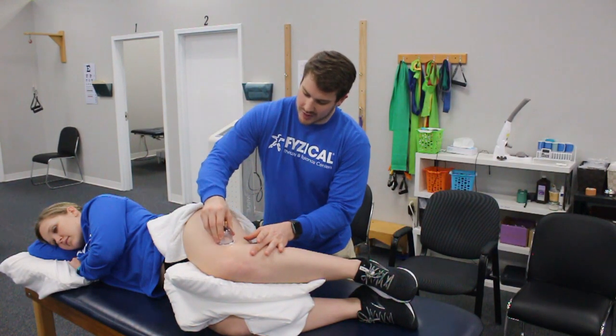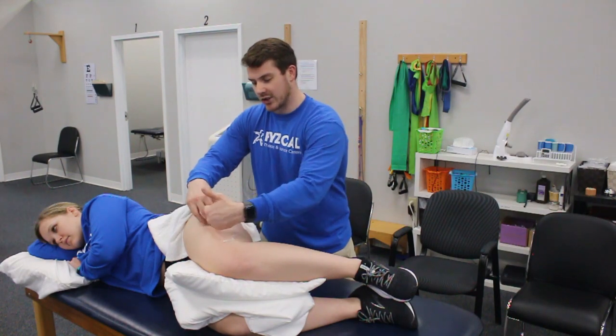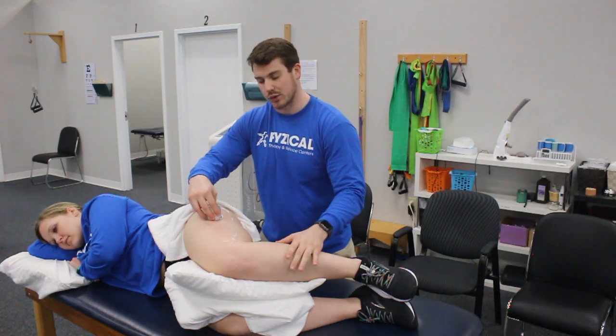It's good to get that entire IT band, and also where it attaches to your quadriceps muscle and to the hamstring.